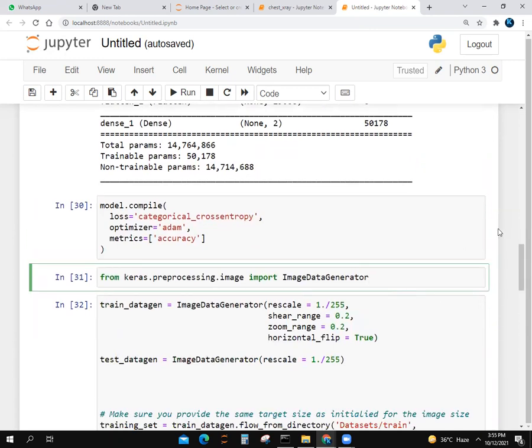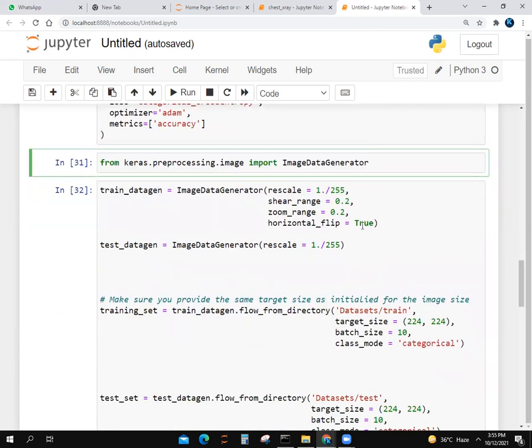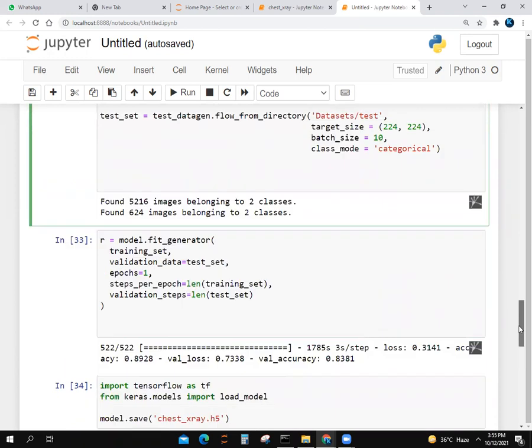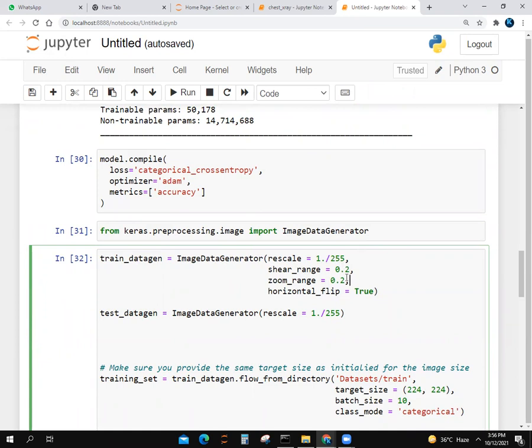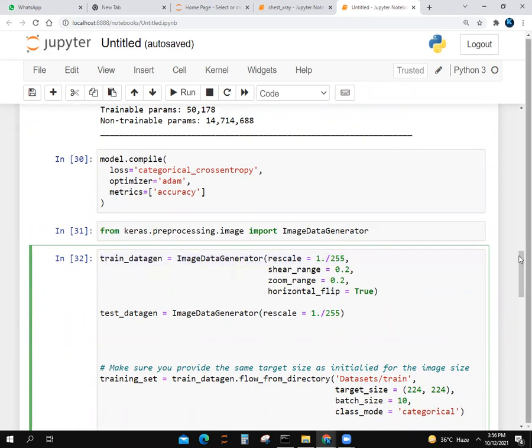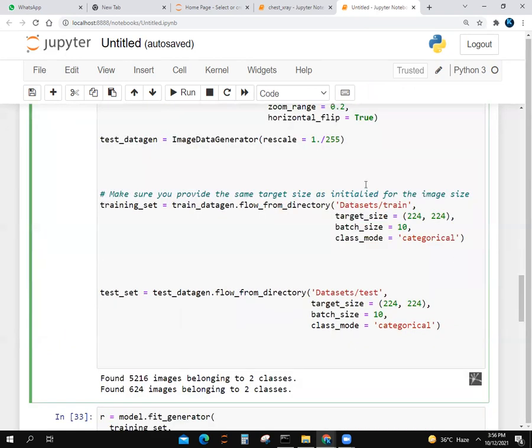Next, we import ImageDataGenerator from Keras again. We find how many images we have. We make a variable named train_data_gen. We use ImageDataGenerator and rescale it to 1/255, with shear_range 0.2, zoom_range 0.2, and horizontal_flip true. We use test_data_gen and scale it to 1/255.